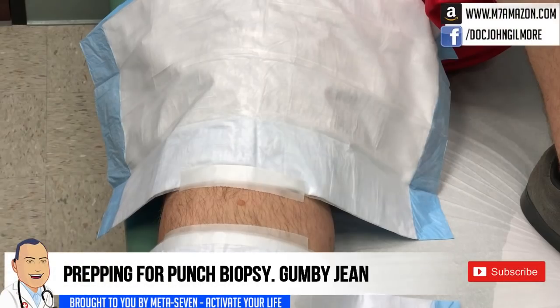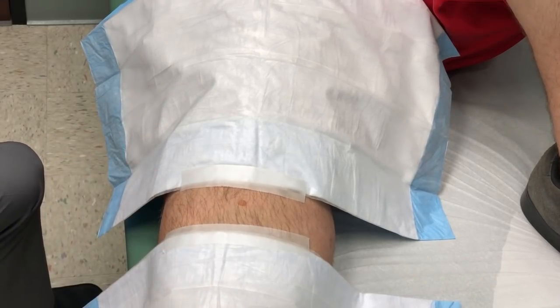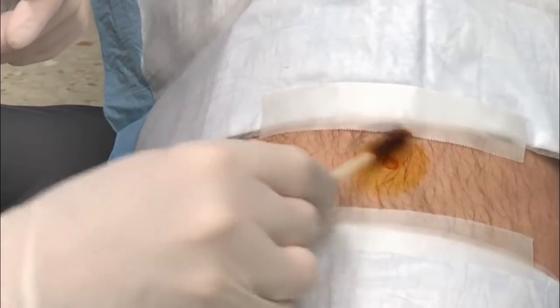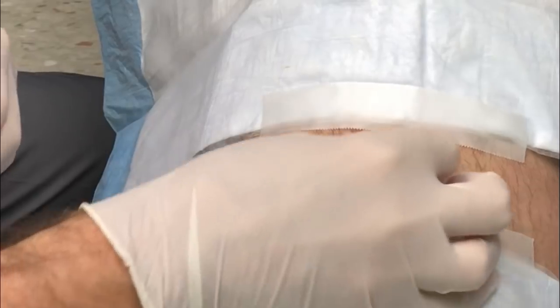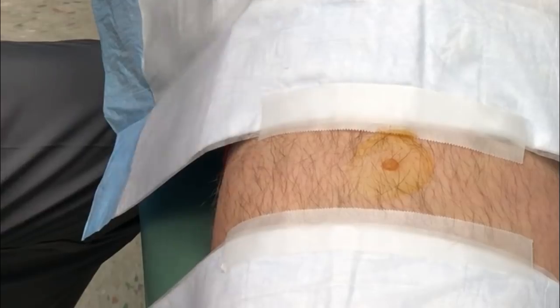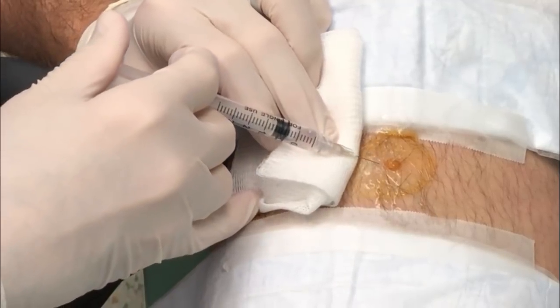We're back with Legend — he's got the lesion on the right leg and we're gonna punch biopsy it right off, put it in a jar, and send it off to the pathologist to make sure it's not anything serious. Are you ready, Mr. Legend?